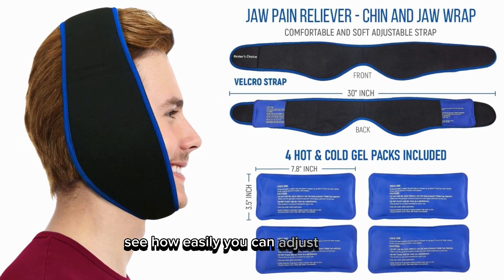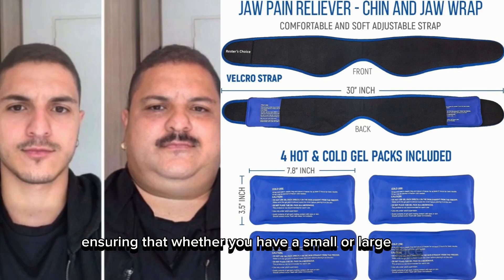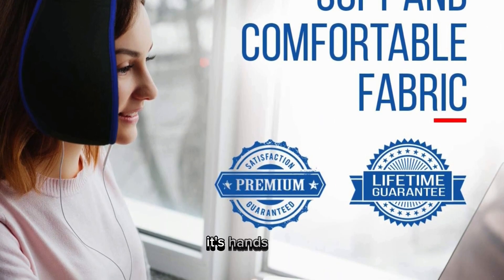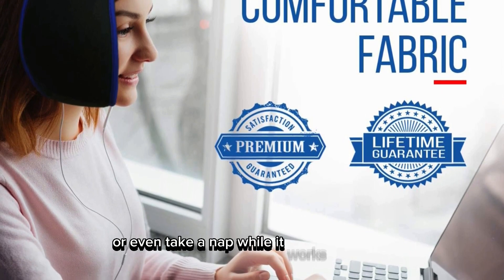See how easily you can adjust the strap. It ranges from 27 inches to 30, ensuring that whether you have a small or large face, you get the compression and relief you need. The pack's usability is a huge plus — it's hands-free, which means you can go about your day, or even take a nap, while it works its magic.